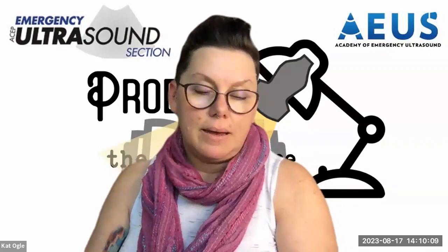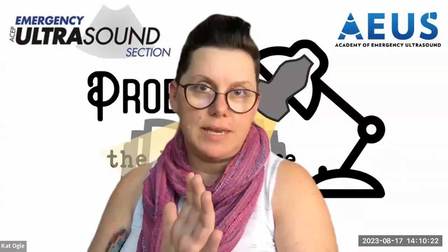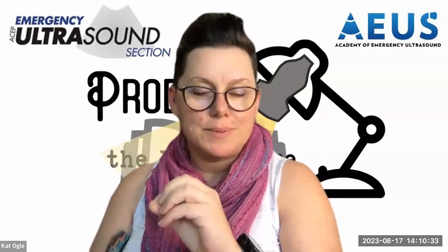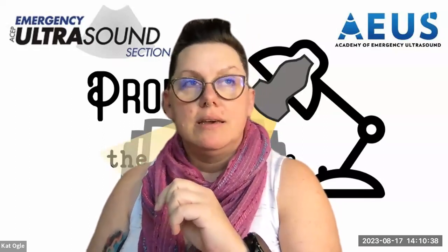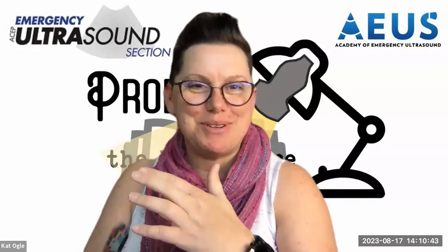And so, as I said, we wanted to look at a dedicated group of trauma activations, and ultimately we were able to identify in the study period 4,860 total eFAST exams that were performed. I'm not sure how the undocumented, technically limited, or incomplete studies are looking in your shops, but we had a 29% undocumented rate. And we knew that we had a problem. Once we started looking at the numbers, we were like, oh, we really have a problem.